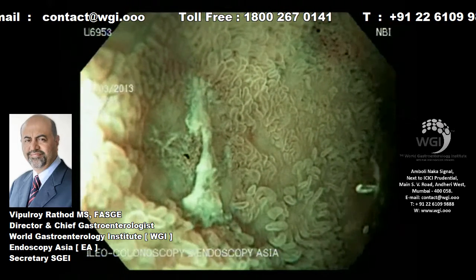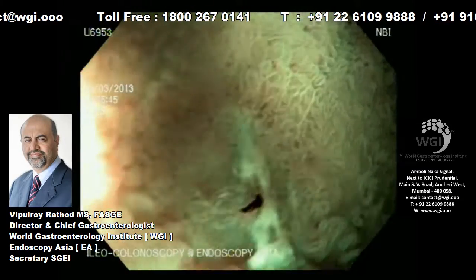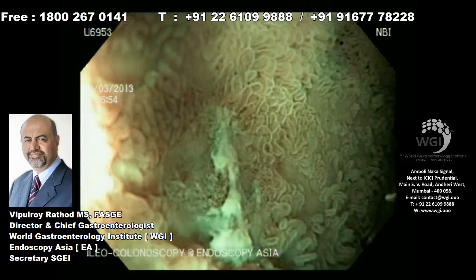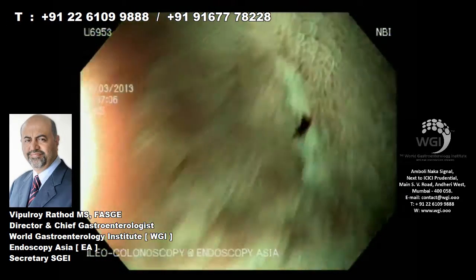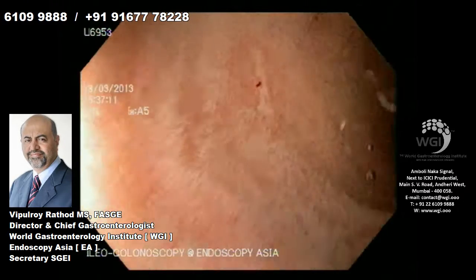This may very well explain her anemia at this stage. We repeated washings and the blood keeps coming back. In these circumstances, we should treat these patients with endotherapy to ensure that this deep ulcer and the bleeding are stopped to achieve resolution of the anemia.